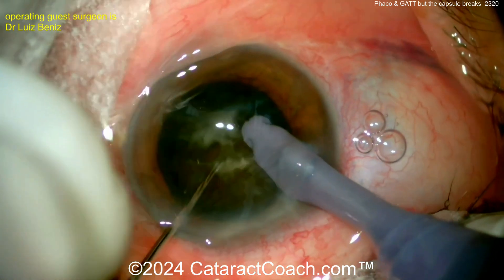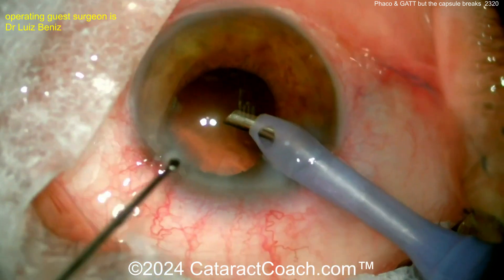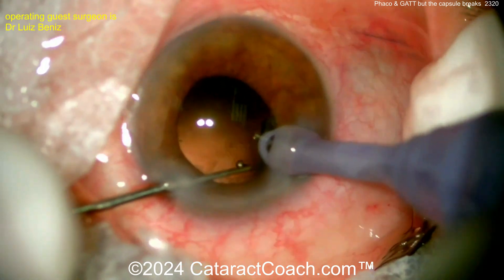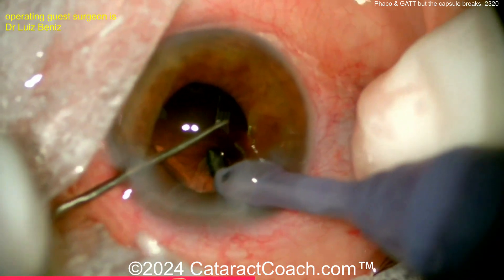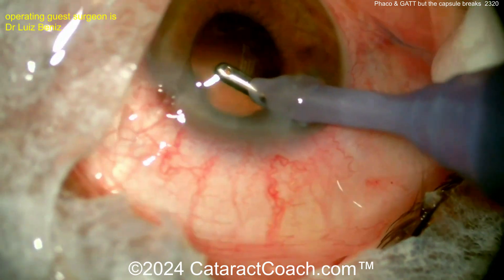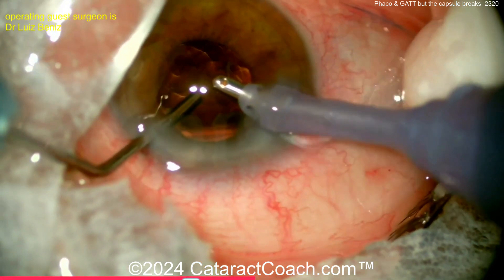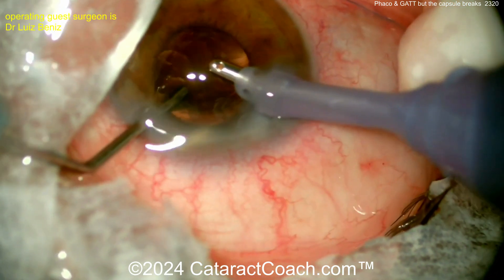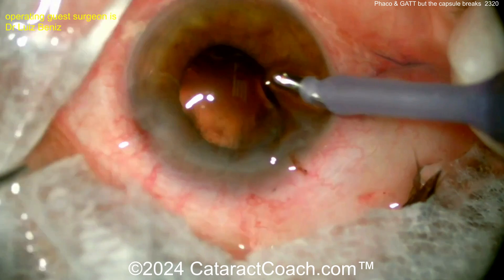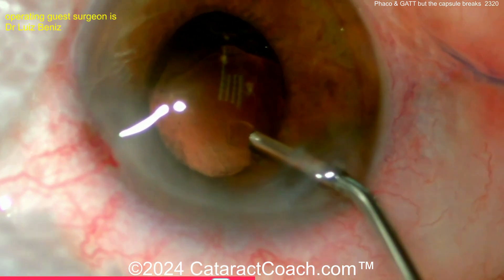Let's see the surgeon doing the cataract surgery and get to the end of it. The cataract's all cleaned up. Nucleus is out of the eye — there's the last little piece. Let's watch carefully during cortex removal. As the cortex is cleaned up — I already told you the answer — he's going to have a break in the capsule. Sometimes it's just due to patient tissue. The nucleus was removed beautifully with no issue, but the surgeon now notices a posterior capsule rent and puts in viscoelastic. Let's look — there is a rent in the posterior capsule.